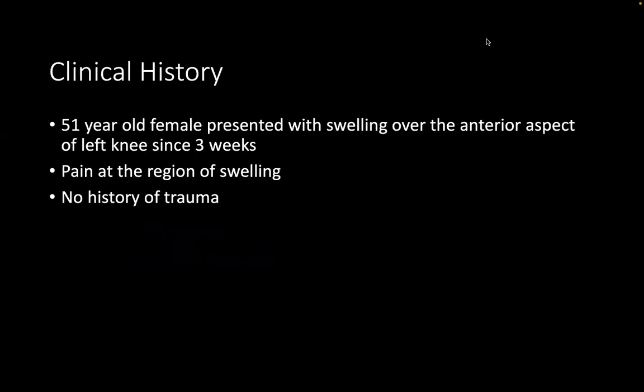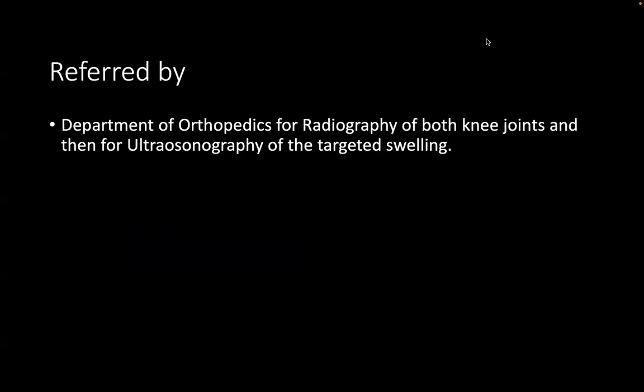So based on the clinical history, a 51-year-old female presented with swelling over the anterior aspect of the left knee since 3 weeks. There was pain at the region of the swelling. However, there was no history of trauma given by the patient. The case was referred to us from the Department of Orthopedics for radiography of both knee joints and then for ultrasonography of that targeted swelling. On asking regarding previous investigations, there were none available with the patient.